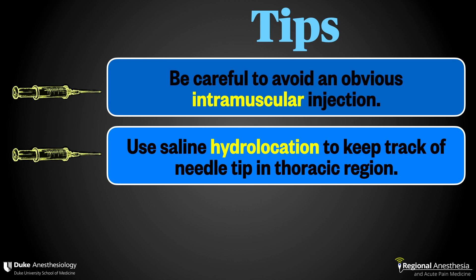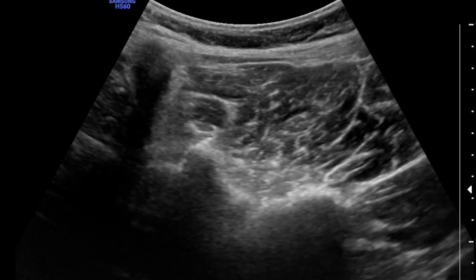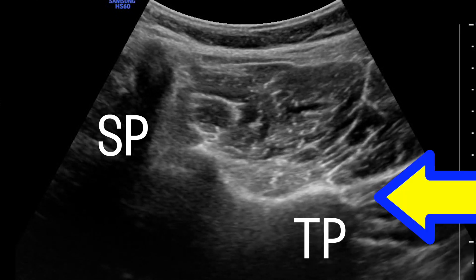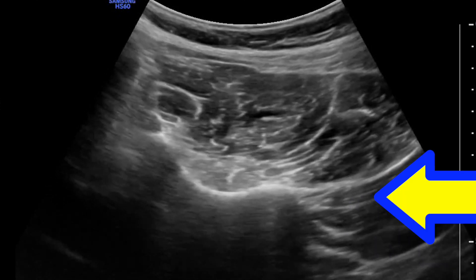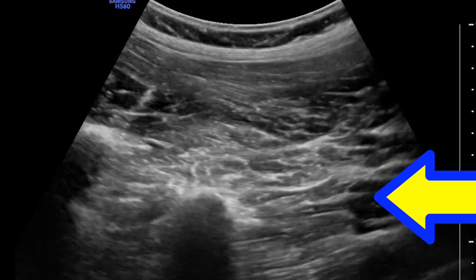Number two, use hydrolocation to ensure you know where your needle tip is. Yes, these do seem less hazardous than paravertebral blocks, but there's been more than one pneumothorax reported in the literature following ESP block, so go slow and with care. And finally, lumbar imaging can be tricky. I like to get a transverse view of the spinous process, the lamina, and the transverse process, and then make a note of the depth. Then I'll slowly turn the probe 90 degrees until I'm in the parasagittal orientation, and with my depth marking, I'm confident that the bone I'm looking at is the TP.